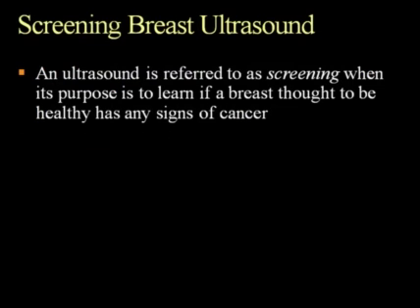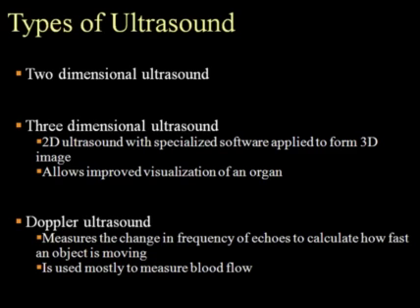Screening breast ultrasound, however, by definition, an exam is referred to as screening when its purpose is to learn if a breast thought to be healthy has any signs of cancer.